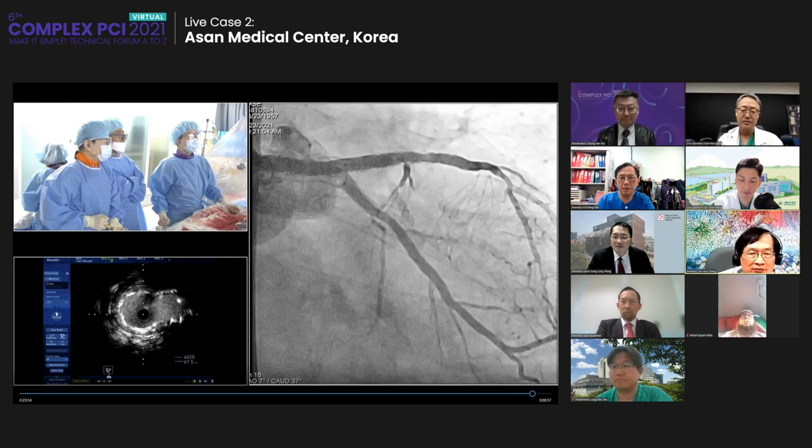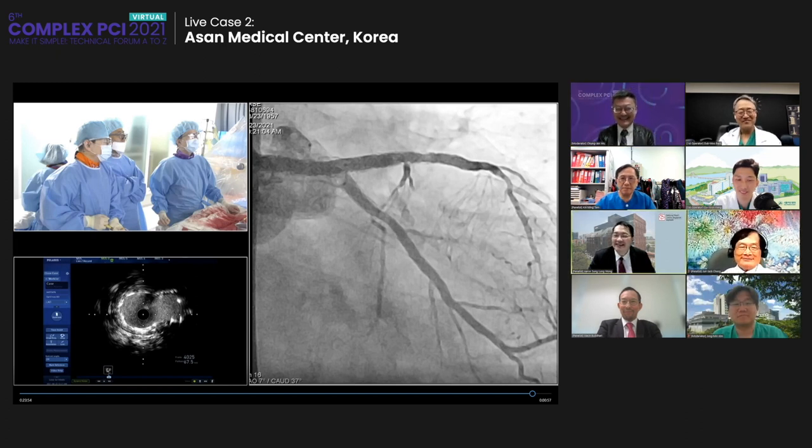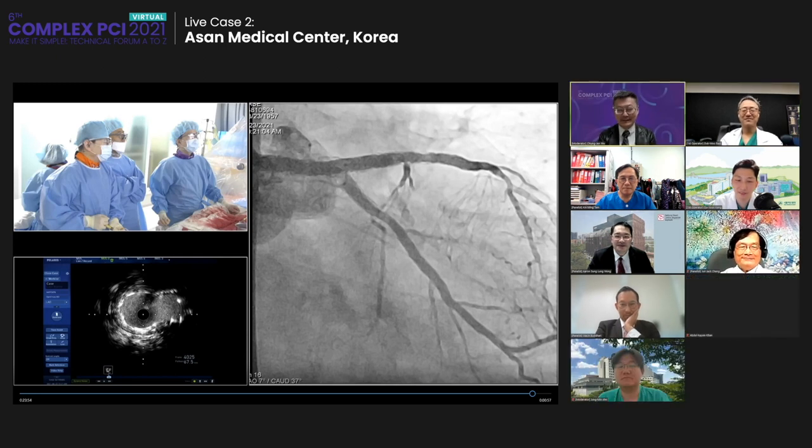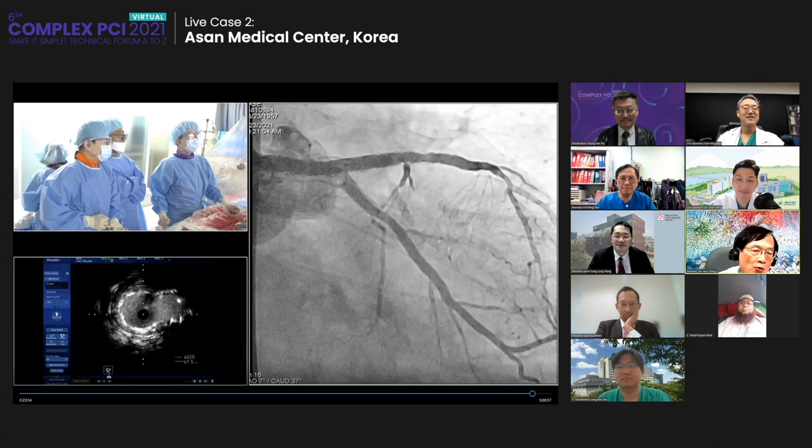How about in the future, in a scenario like this case, will you try the paclitaxel DCB and then the sirolimus DCB added on? Would the two combined be better? I don't know. We need a randomized trial. Yeah. Maybe SJ was conducting another trial for both paclitaxel versus sirolimus coated, because ISR is quite high for this case, especially now the limus DES is a long stent.